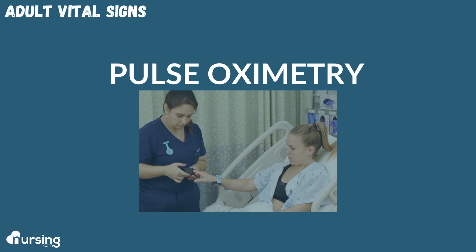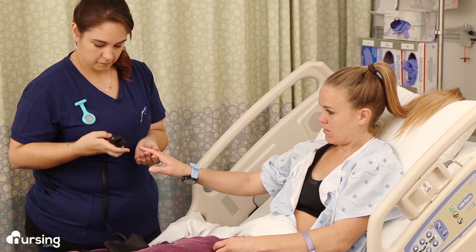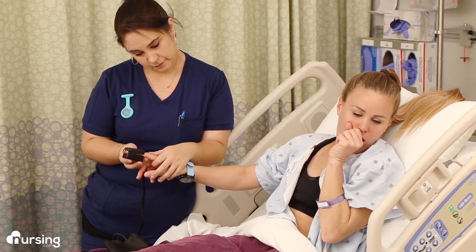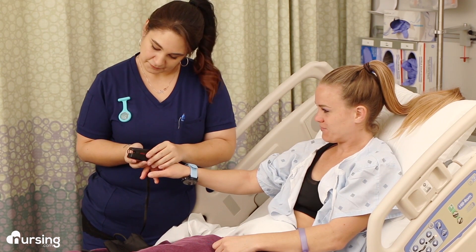Next we're going to do pulse oximetry. Make sure your patient's fingers are nice and warm — you can even wrap them in a warm towel if you need to, because you need good circulation. Also, we don't want them to have nail polish on. Just apply the probe with the red light on top of their fingernail, and you should get a result in about five seconds.